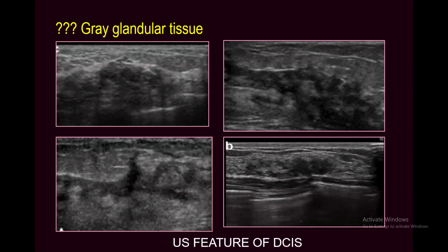At the end, I started to think about MRI. Some of those patients, you see, I have done MRI for them, and I found correlating non-mass-like enhancement. I said, why not describe this lesion as non-mass-like enhancement, as non-mass-like lesions?